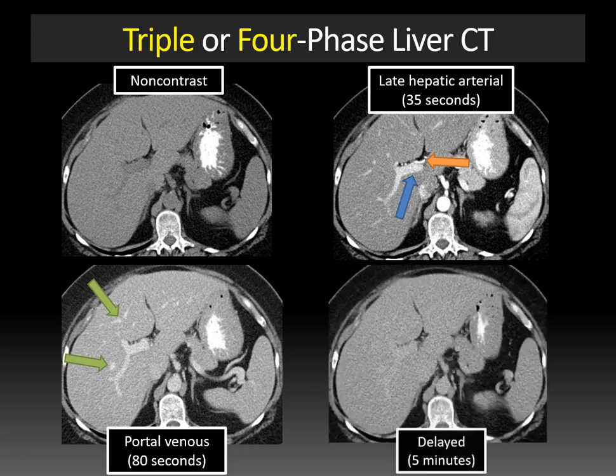Finally, we have the delayed or equilibrium phase, which usually starts around four to five minutes and can continue to 10 minutes. At this point, contrast starts to leak out of the liver, and everything starts to fade out a bit.